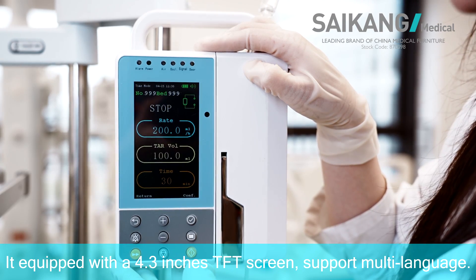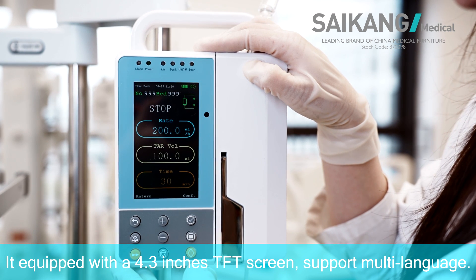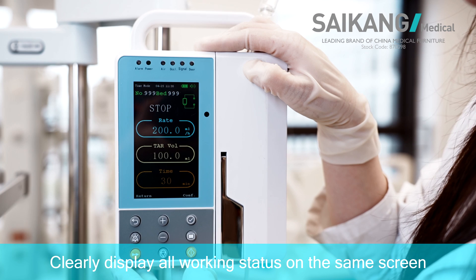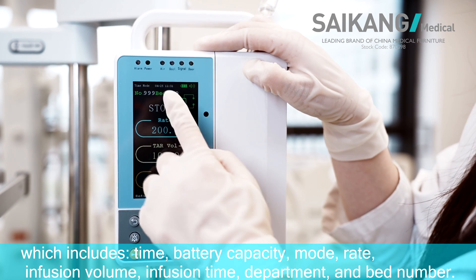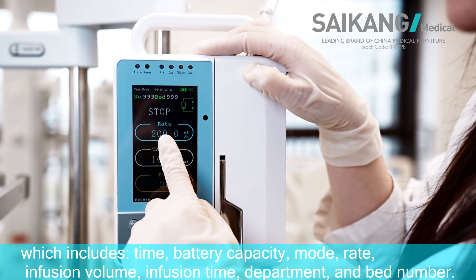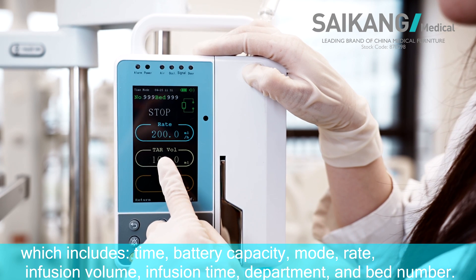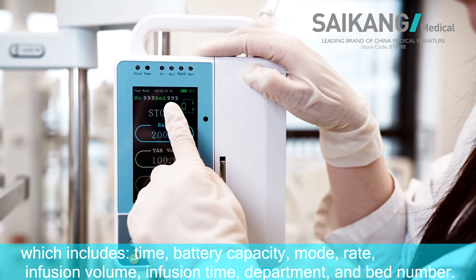It is equipped with a 4.3-inch TFT screen that supports multi-language. It clearly displays all working status on the same screen, which includes time, battery capacity, mode, rate, infusion volume, infusion time, department, and bed number.